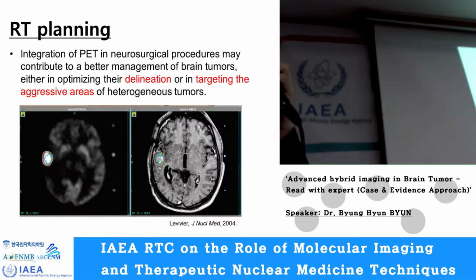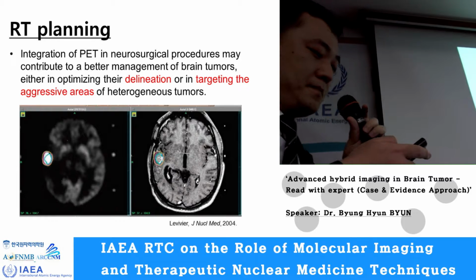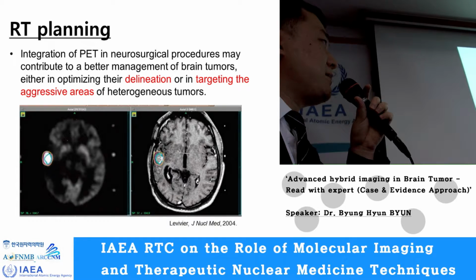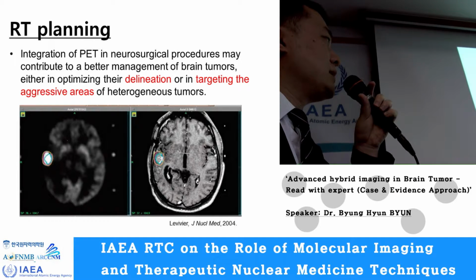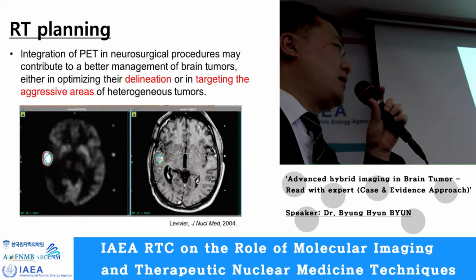And the final application of the usefulness of pre-treatment PET is radiotherapy planning. Integration of PET in neurosurgical procedures may contribute to a better management of brain tumors, either in optimizing their delineation or in targeting the aggressive areas of heterogeneous tumors.